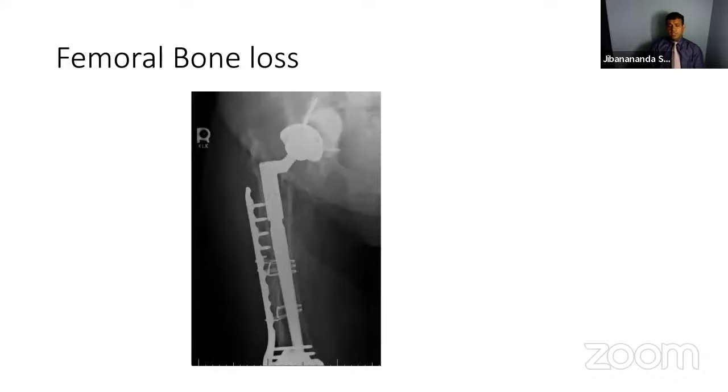And then when we revised it, I did have a perforation in spite of all the watching. I couldn't get a good fit, so I protected the perforation with a plate and a stem. Obviously, even though this is the shortest stem, it almost goes to the knee. Our intra-op cultures were negative, so we left the cement medially as it is, and then used a large cup with screws medially and laterally to hold it well.